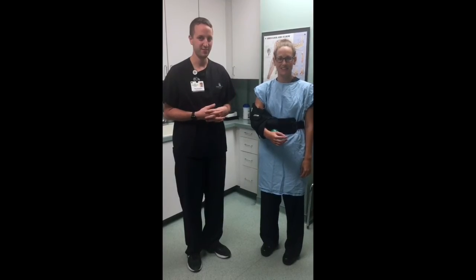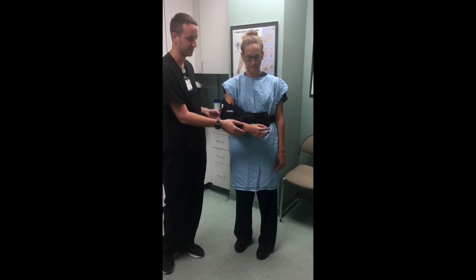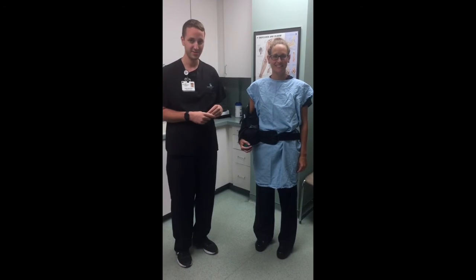These are going to be a few examples of how not to wear the sling. In this first example, the patient's wrist is extended past the sleeve. This will cause the patient's wrist to drop down and droop and give the patient some wrist pain and hand pain. Here's example 2 of how not to wear this sling.